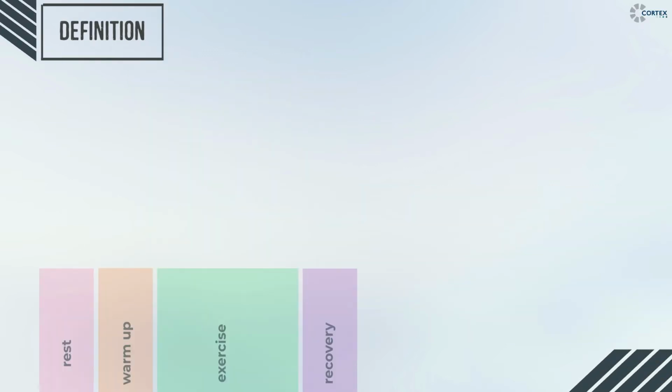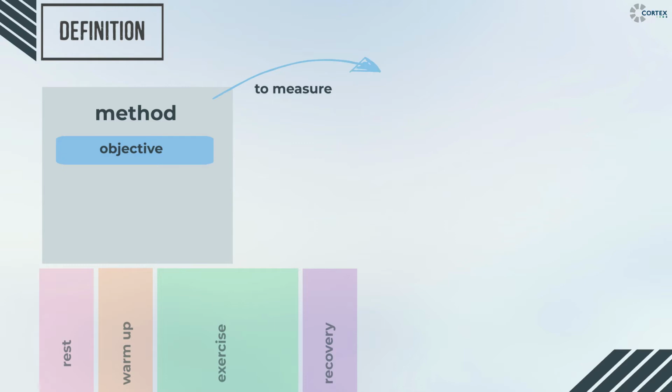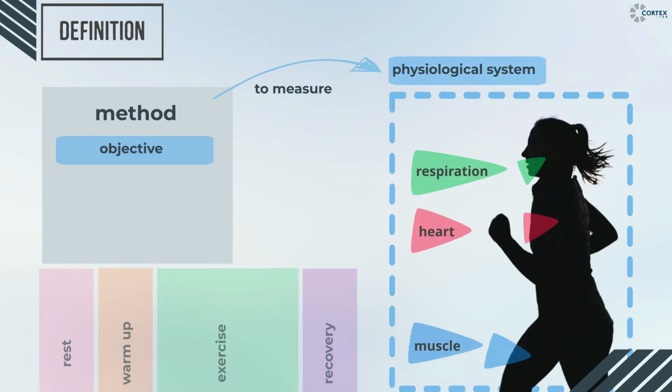An exercise protocol is the specific method that brings the subject to the agreed physiological stress. By doing so, we can objectively measure and assess the physiological system of an individual. For each circumstance, a valid and well-grounded protocol needs to be selected, which then can be easily reproduced from the software for later use.